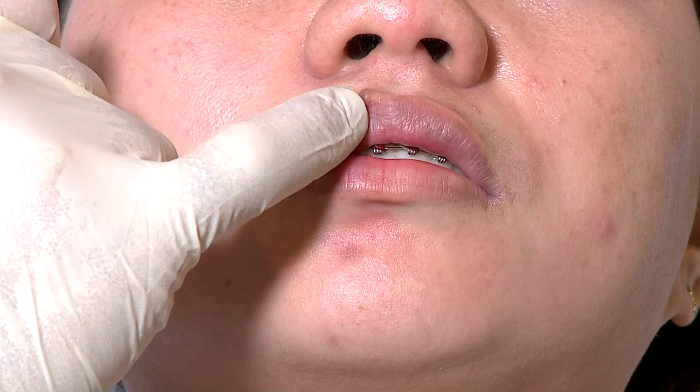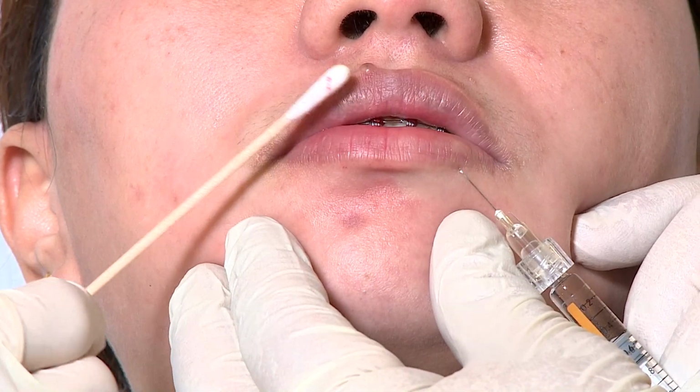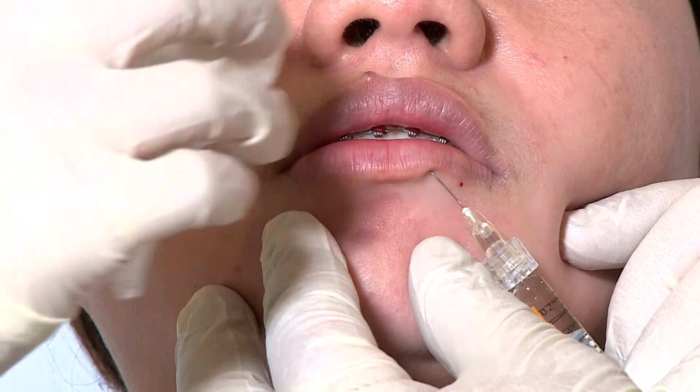So two points of injection in the upper lip were 0.05 and 0.05, and here we do two points of injection, 0.1 and 0.1. Again, approaching from the skin to the mucosa, injecting 0.1, another 0.1 here.